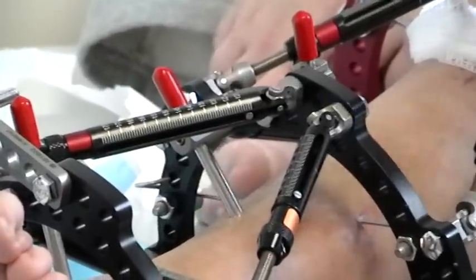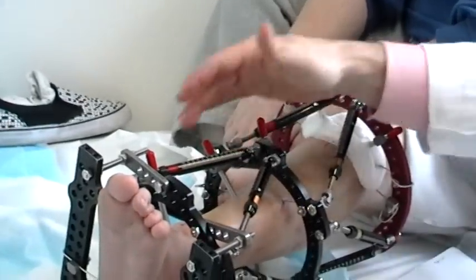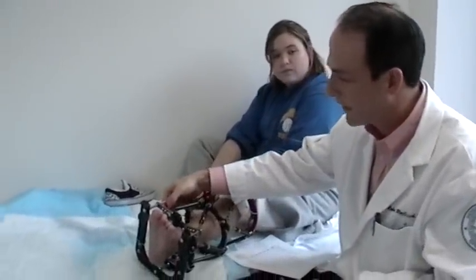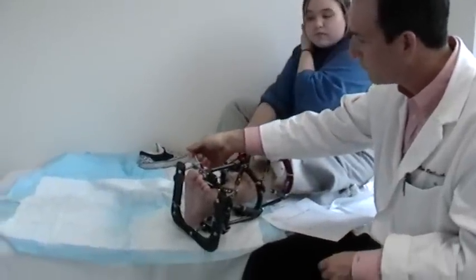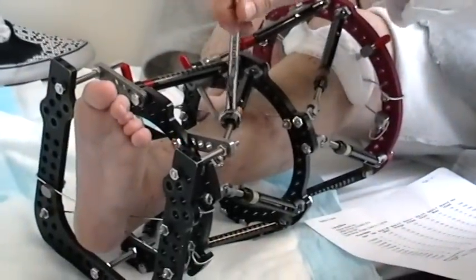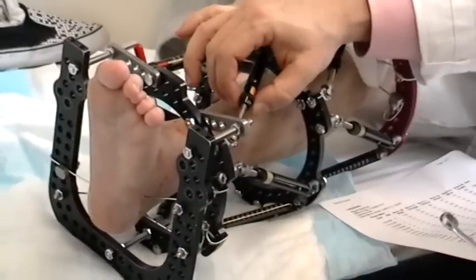Did that hurt? It's barely perceptible because it's so gradual. There are potentially times where the strut gets tight and it's hard to actually move it by hand. We'll give you a wrench so you can move the strut by putting the wrench on that little dial piece. But most of the time, you can really just do it with your hand.